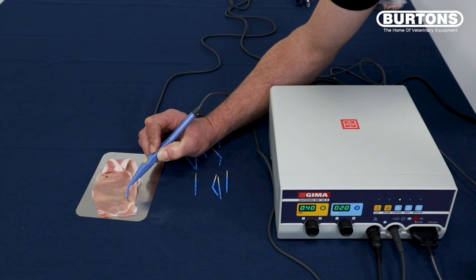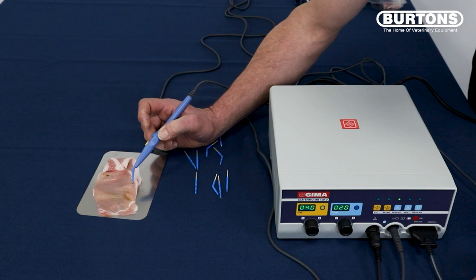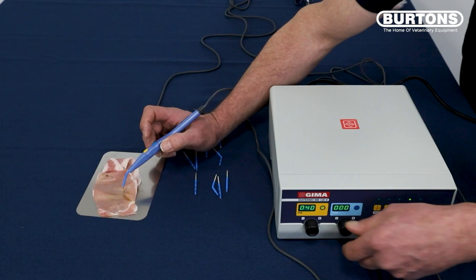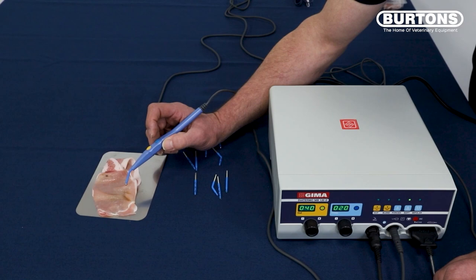And the opposite to that is if we use soft, for if we don't need a lot of penetration. Again, we've reset to zero because we've changed the buttons, so we need to change this back up again. Setting again at 20, foot on the foot pedal — and hopefully you can hear that's a lot gentler.